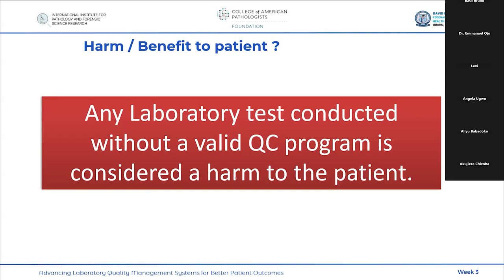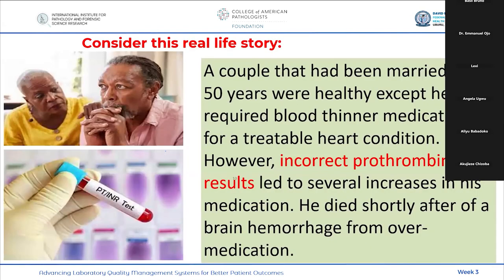of the clauses of ISO 15189. So we should start seeing in our laboratory operation, do we have laboratory tests that are conducted without a valid QC program? What are the alternatives? The standard was also clear where IQC programs or IQC materials are not available for a particular test, what are the acceptable alternatives? But in all of this, what is important is that there must be a quality control program for any of the laboratory tests that we are conducting in the lab.